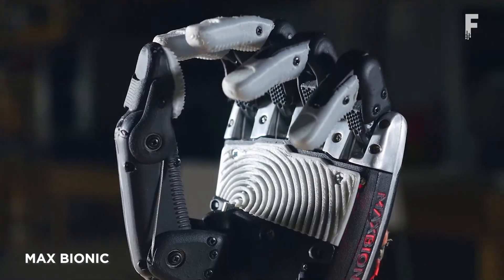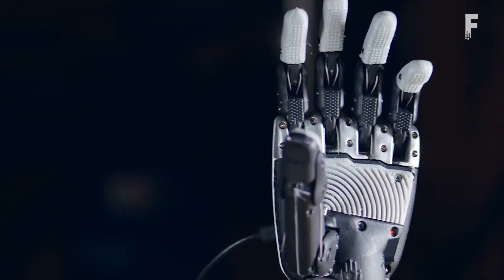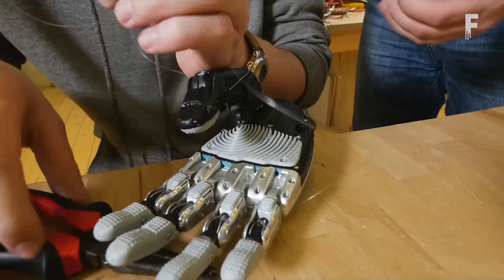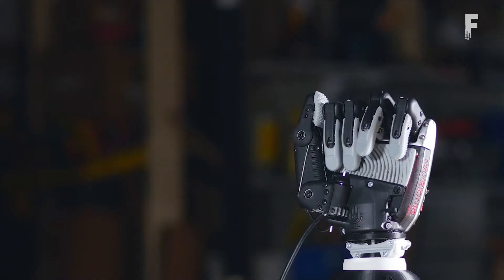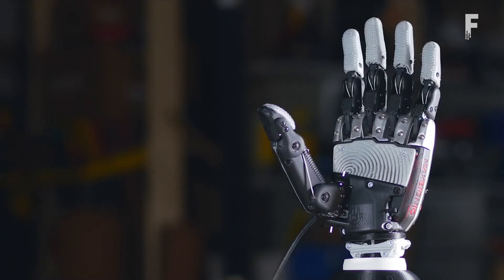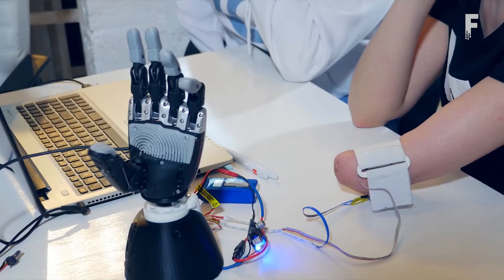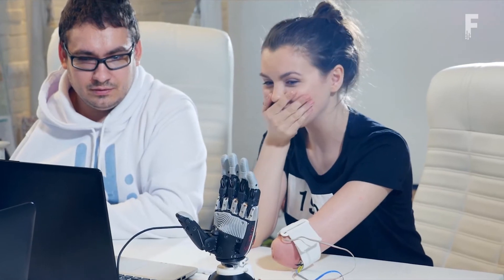Max Bionic is a 3D printed bionic arm that can make life easier for lots of people at a fraction of the cost of other advanced bionic arms currently on the market. The bionic arm can be operated using a single external power source and programmed to respond to a person's thoughts to execute the right moves. The large surface area of the touch buttons allows users to control the functions of the prosthesis intuitively. Reference points, made in the form of one or two spheres recessed in the surface at different ends of the sensor, allow switching modes by touch without visual contact.